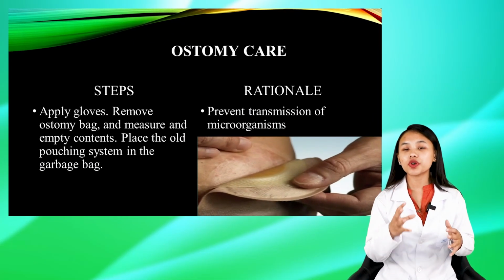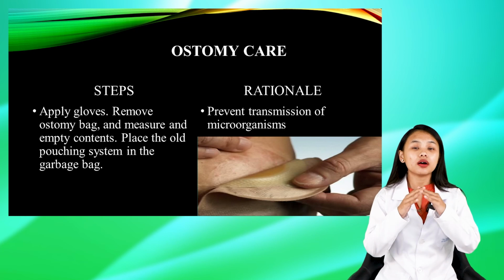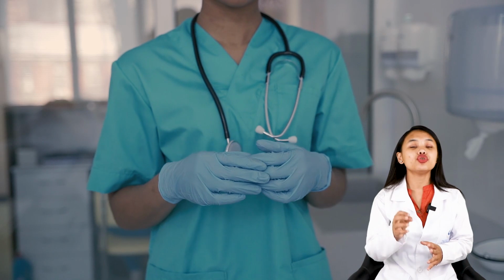Once the pad has been placed, you must make sure that you wear your gloves before you touch the bag, and you must remove the ostomy bag, as well as measure and empty the contents.